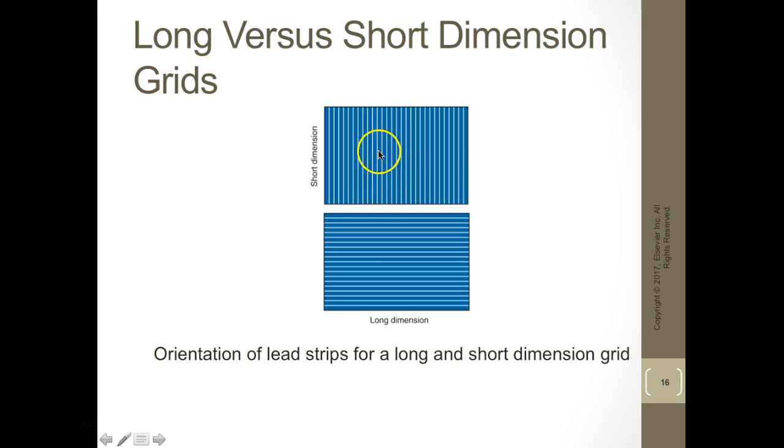So you're going to angle down or up, caudal or cephalic, and you're not going to have any grid cutoff. So it's perfect for a chest x-ray. This is perfect for a KUB, or any kind of long bone. You can lay the patient's head here and the feet down here and shoot the abdomen, and you can angle cephalic or caudal, but you can't angle left or right.